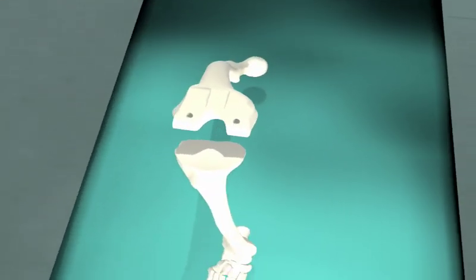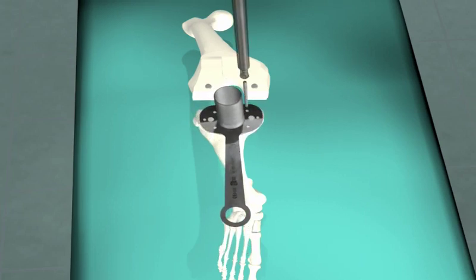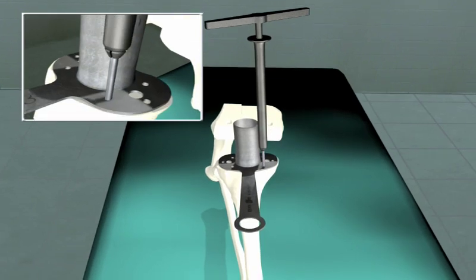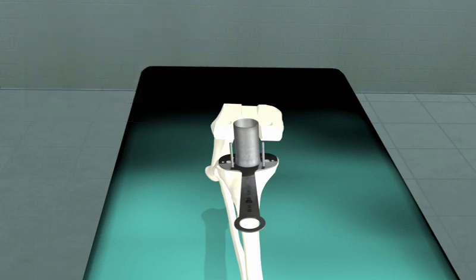The tibial preparation is a rapid, easy to perform procedure which involves taking the properly sized template that fits just within the bony borders of the tibia, and this template is then pinned into place, and using a conical reamer, the central conical preparation is completed in one motion. Pins are removed and the template is removed.